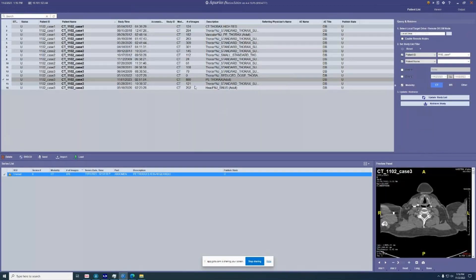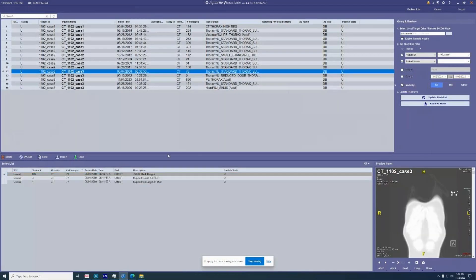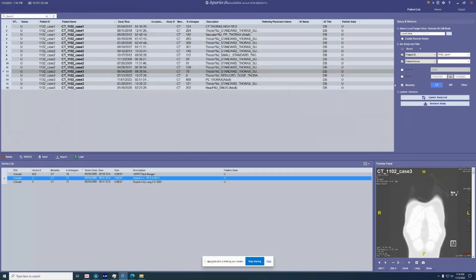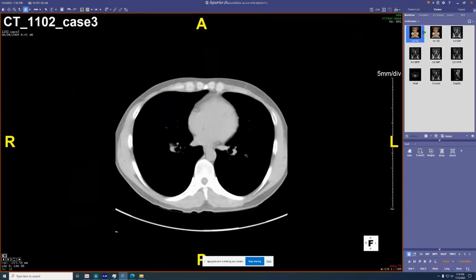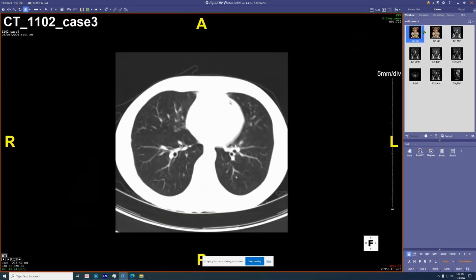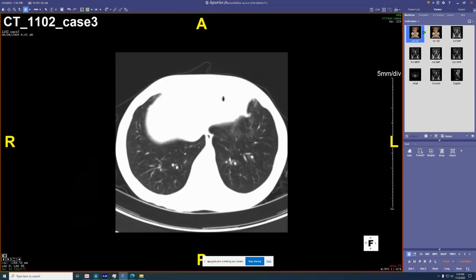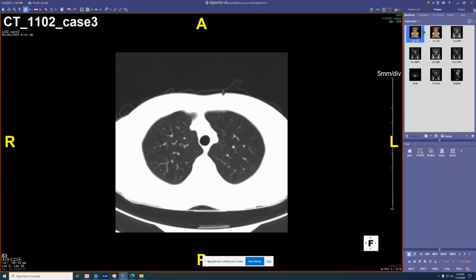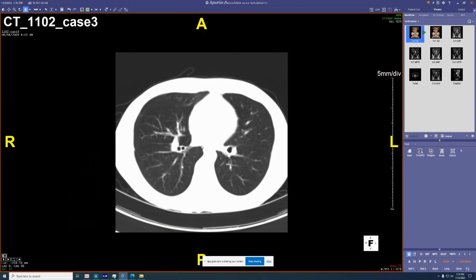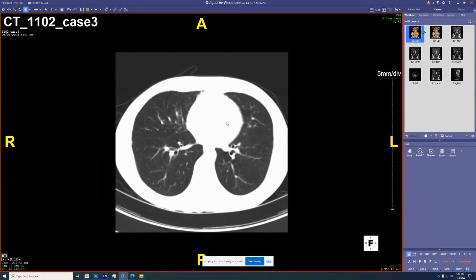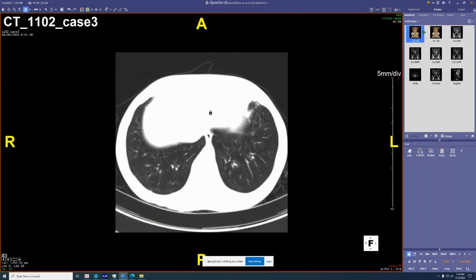Going back to 2009, you can see she's had similar findings — though I don't know how people read things on five-millimeter slices. This patient has had findings of what looks like chronic infection. NTM is weird to be lower-lobe predominant, but some sort of chronic bronchiolitis. This is actually a biopsy-proven case of pan bronchiolitis.